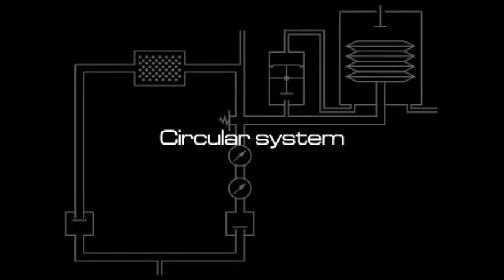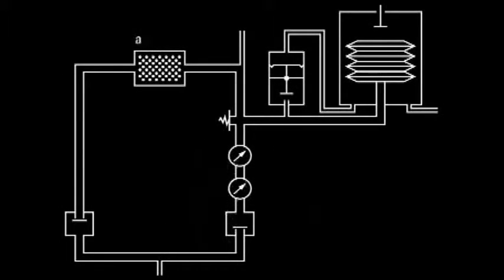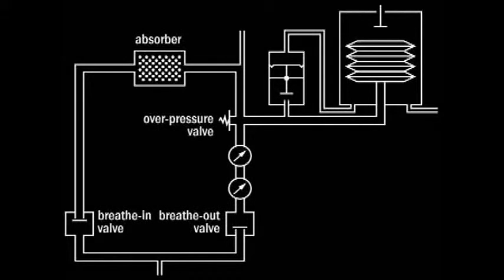Circular system. Our next graphic depicts a schematic view of a workstation connected to a half-closed circular system. This type of arrangement allows a time-controlled artificial respiration suitable for multiple applications.